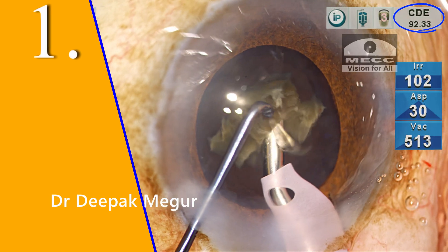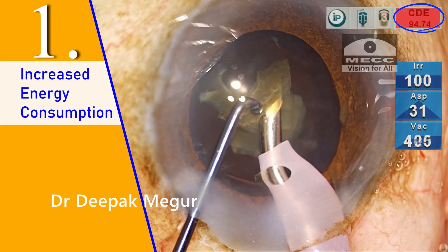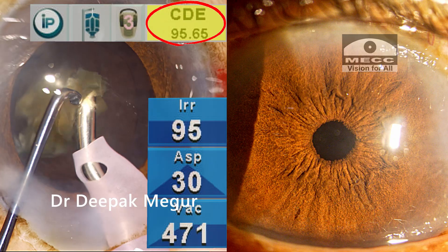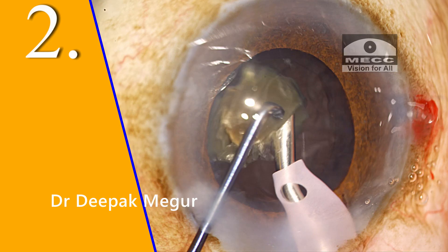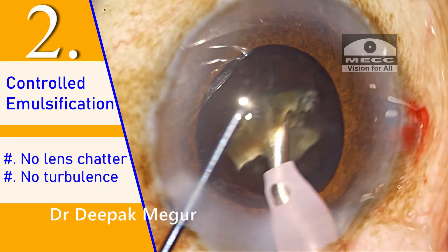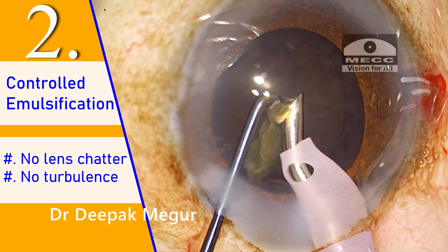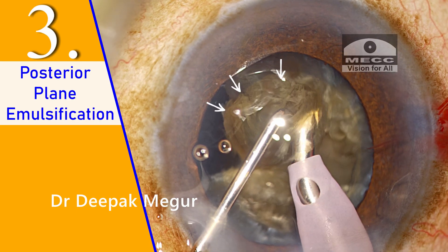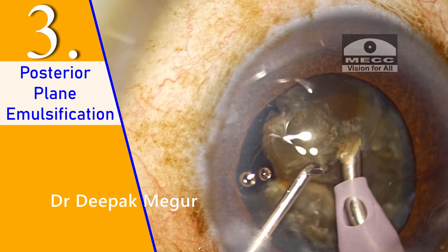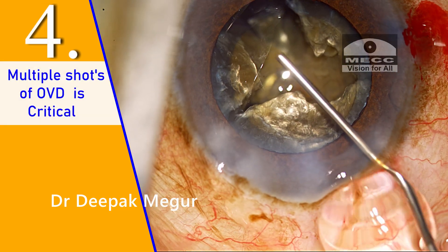The next day, the patient is quite happy and so am I — the cornea is clear with minimal anterior chamber inflammation. There are few learnings: the first common myth is that increased energy consumption is deleterious to the endothelium. This is not entirely true. Ultrasound energy alone is not responsible for endothelial damage. Despite such high energy consumed, the cornea was crystal clear. The more important factors are controlled emulsification with very little chatter and turbulence — these principles are far more critical in minimizing mechanical trauma to the endothelium. Working at a more posterior plane also minimizes exposure of ultrasound energy to the endothelium. Frequent OVD application is extremely critical in protecting the endothelium.